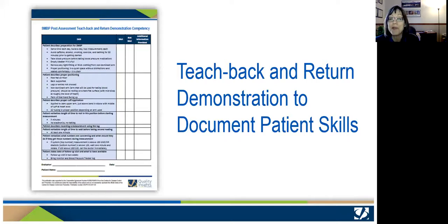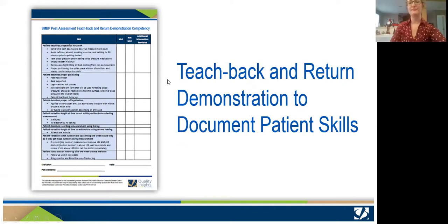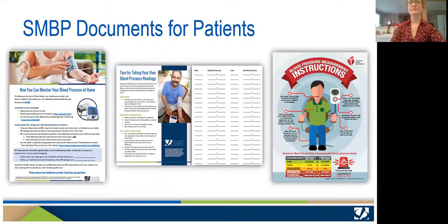And it has some places for you to check off if the patient has demonstrated the skill, and maybe if they need additional review, you can also check that off. So today, I'm going to be teaching Danielle as our practice patient, and I would encourage you to keep this document handy, and actually you can assess her competency as we go along. So we would be ready now to jump in.